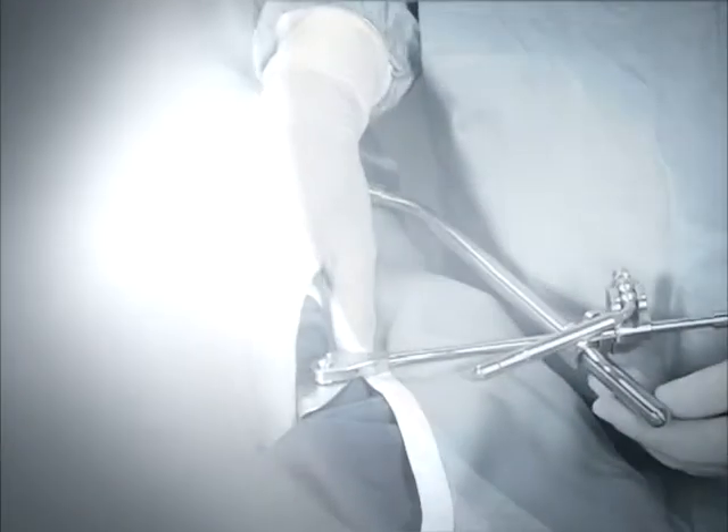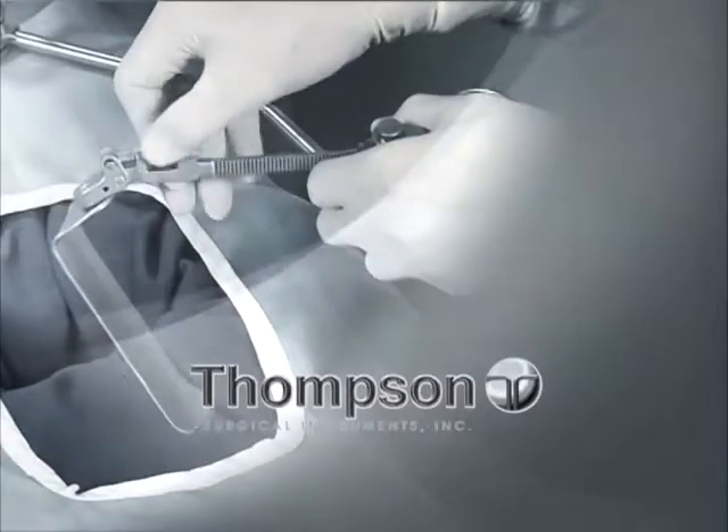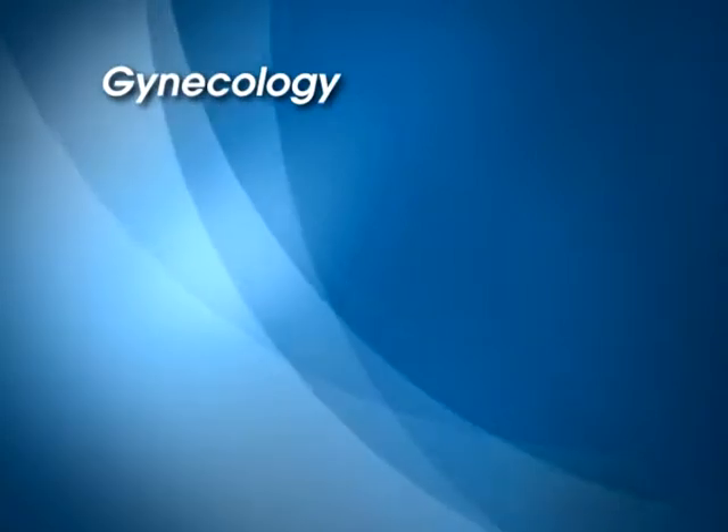The Thompson Retractor is the original table-mounted retractor that outperforms any other retractor system, including the human hand. In GYN surgery, the Thompson Retractor offers the following exclusive advantages.